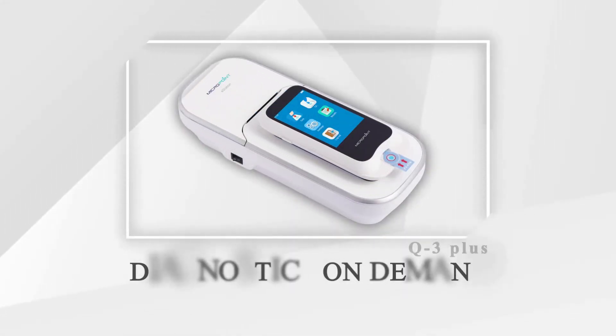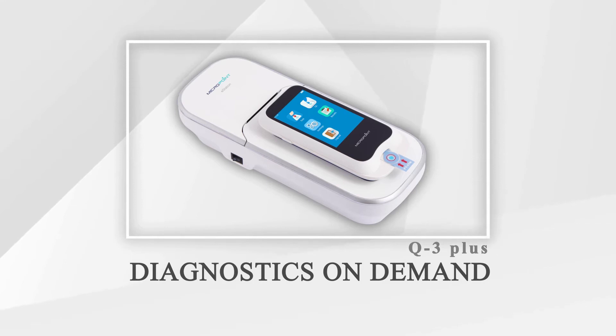Thank you for choosing the Q-Labs Meter. It was made for both healthcare professional and self-test use.